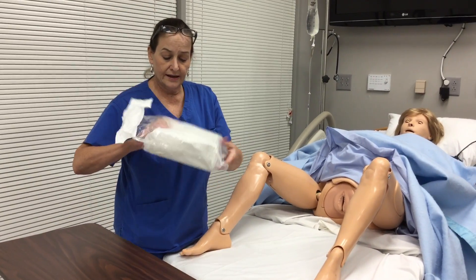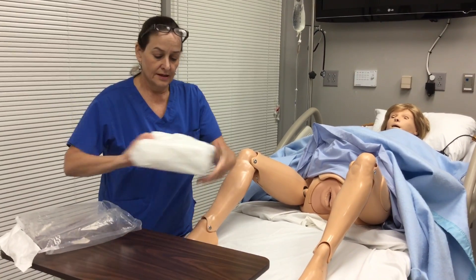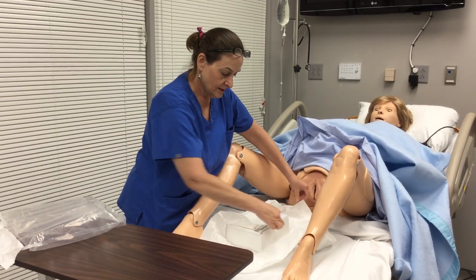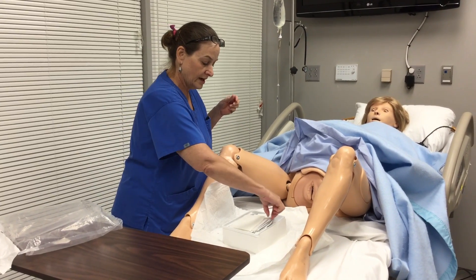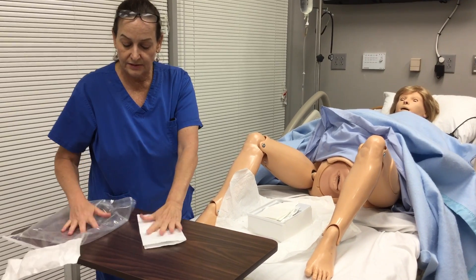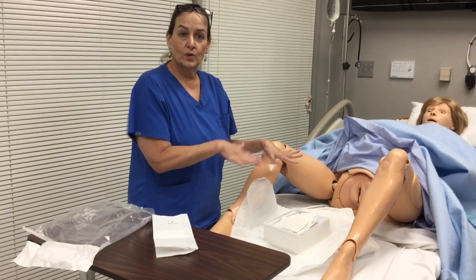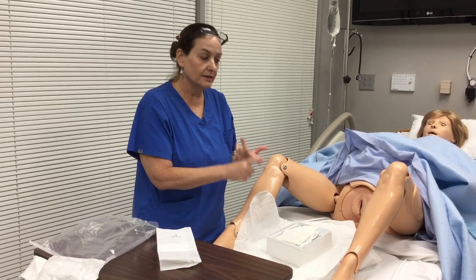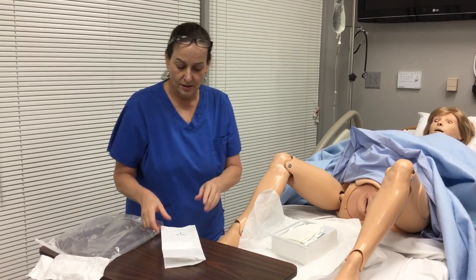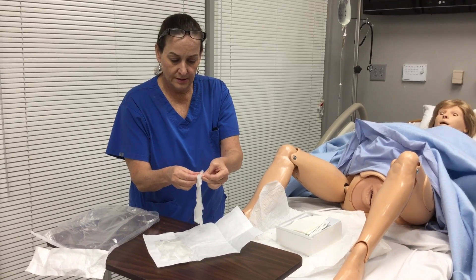You're going to open up your Foley catheter. Make sure you open it right side up — sometimes I've opened them upside down and had everything spill. You're going to open up your kit sterilely. Then you're going to have your gloves. I do want to point out that you will see different people do things in a slightly different sequence. With any catheter insertion, there are two important things: you don't break sterile technique, and you get it in the right hole. There is no wrong way as long as you do those two things.